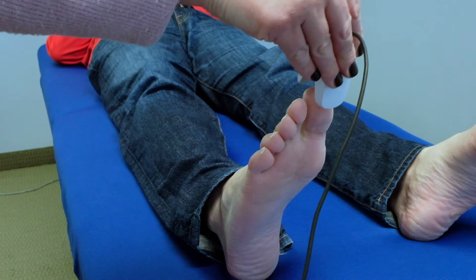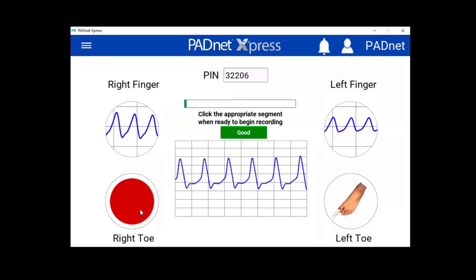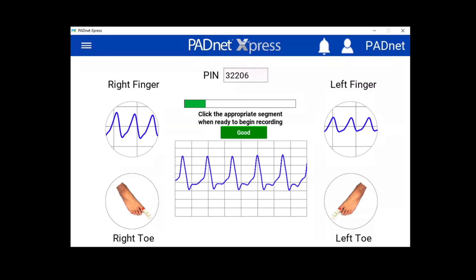Next, place the probe on your patient's great toe. Click on the desired toe to record segment.